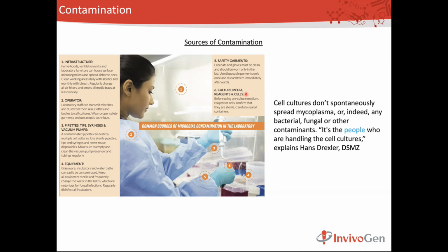But now, many more people are paying attention to aseptic technique, to have better control and management of their equipment and also the culture media. It is quite unlikely that the source comes from this hardware.